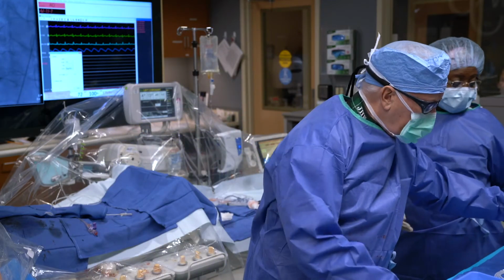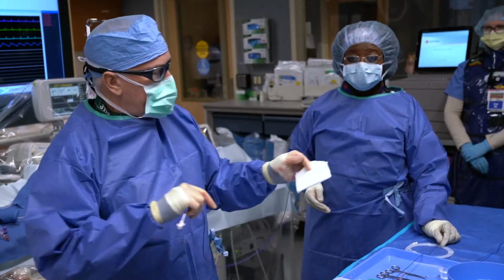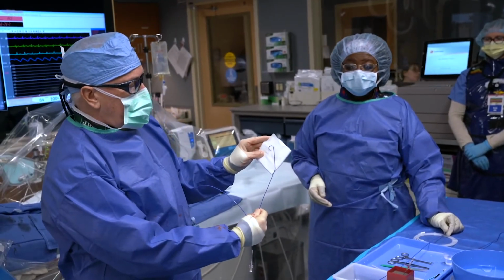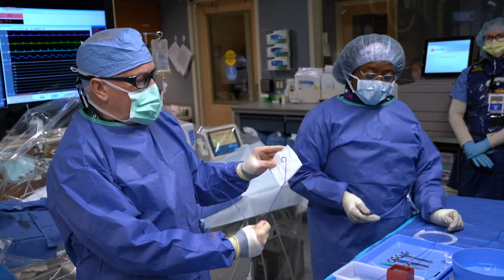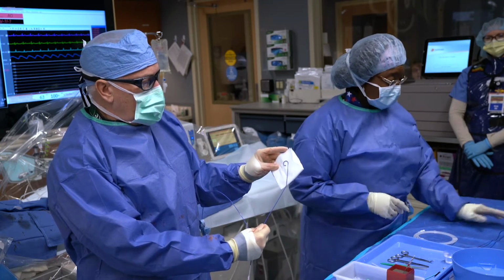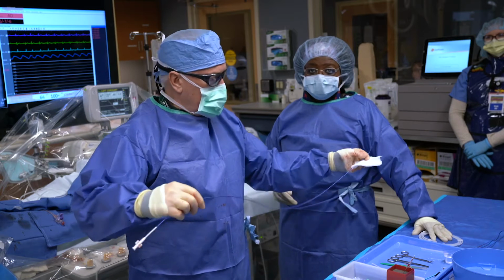And then another catheter that we use will allow us to see the patient's heart strength and heart function. And this is called a pigtail catheter. And these catheters will be placed in the patient's left ventricle to allow us to see how well the left ventricle is beating, which is the strength of the heart.